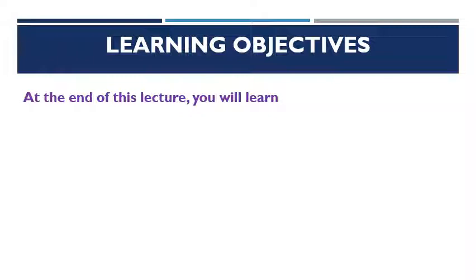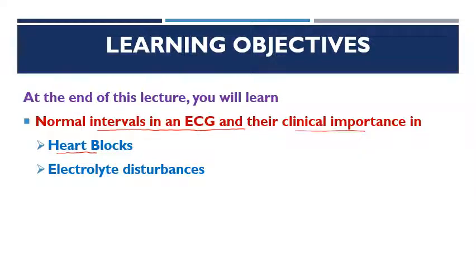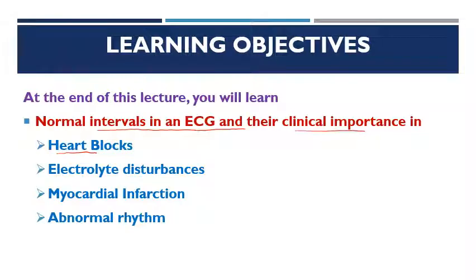At the end of this lecture, you will be able to learn normal intervals in an ECG and their clinical importance in diagnosing heart blocks, electrolyte disturbances, myocardial infarction, that is one of the major causes of death all over the globe, abnormal rhythm of the ECG, and in calculation of heart rate from the ECG strip.